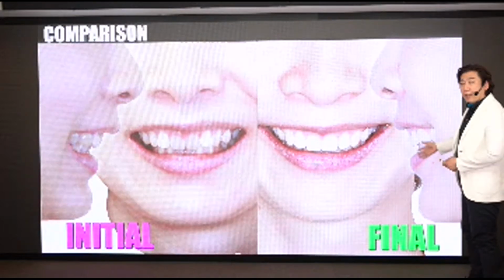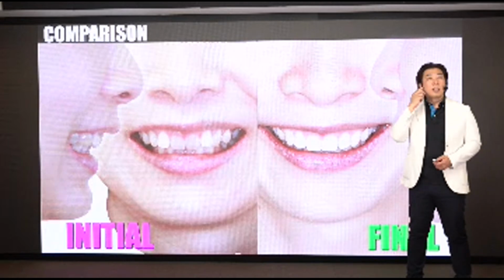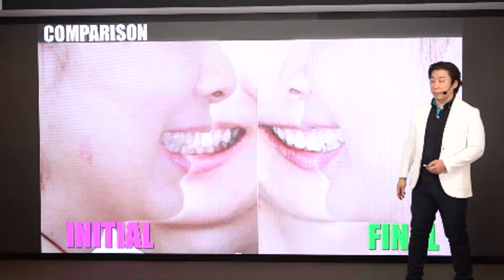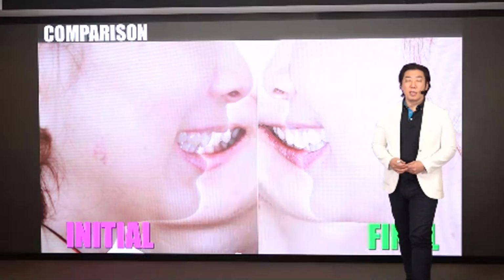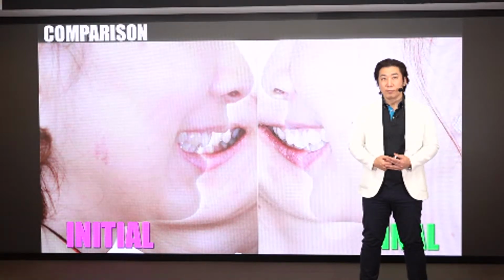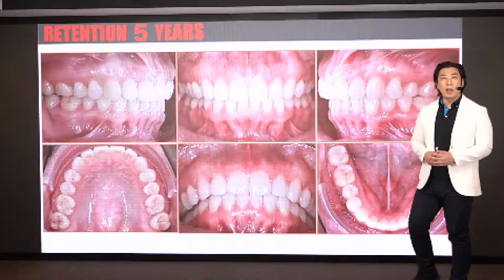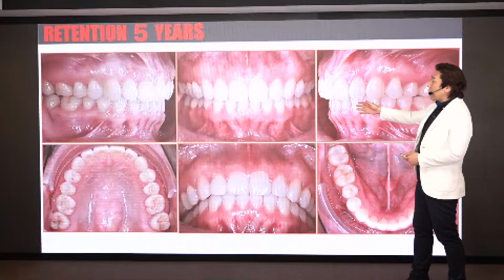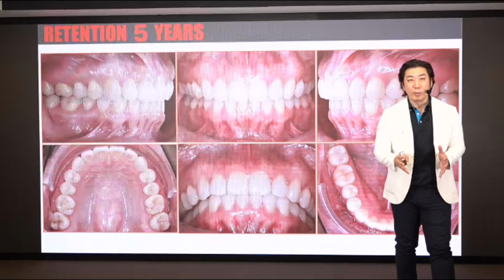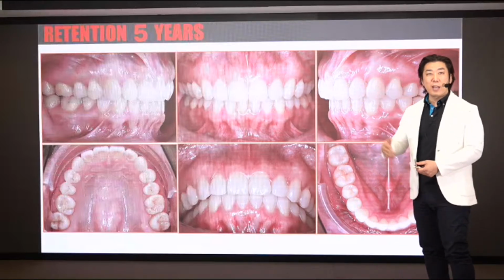Initial and final: the tooth position, joint, airway, and smiling, everything. This is aligner orthodontic potential. A very important thing, not only tooth alignment. This is 5 years retention. After the end of the orthodontic treatment, this is a 5 years retention phase.